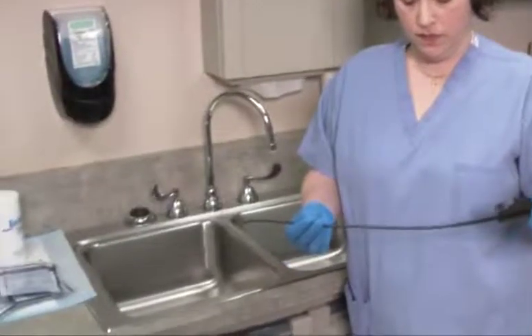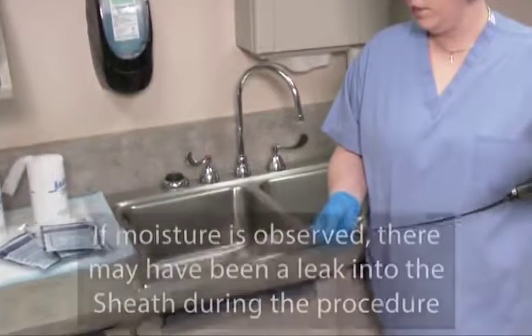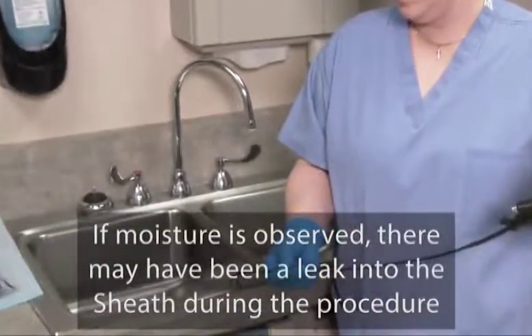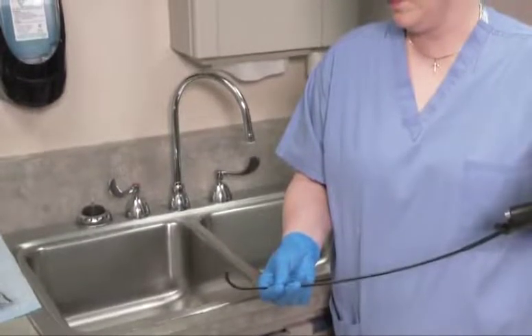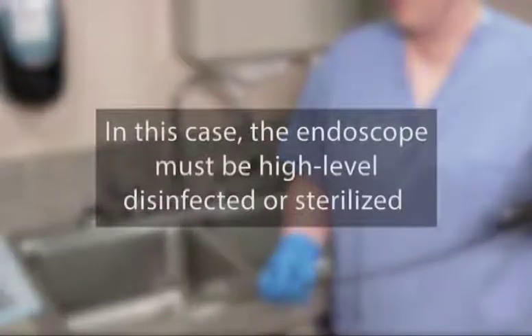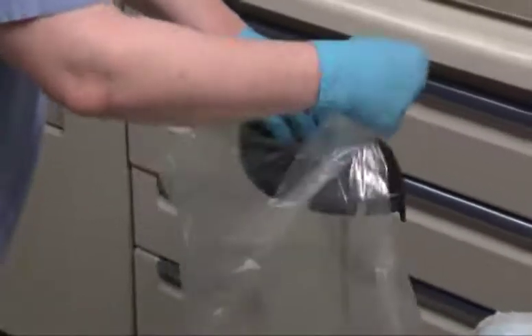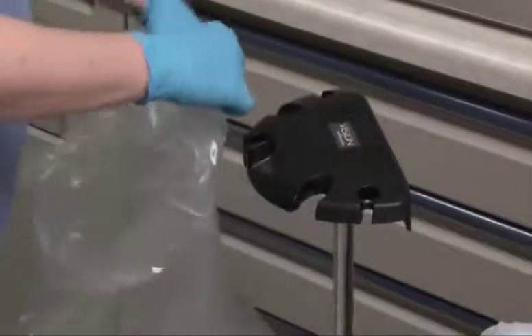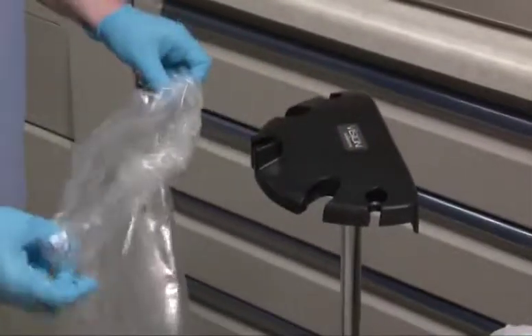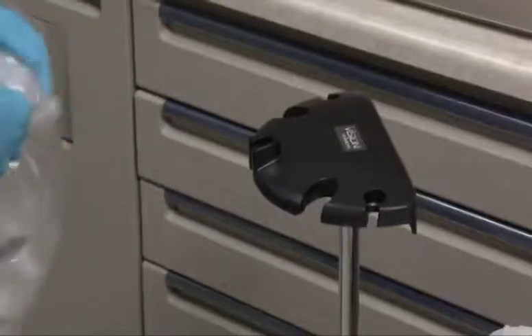Inspect the insertion tube and distal tip and confirm that these areas are dry. If moisture is observed, there may have been a leak into the sheath during the procedure, provided that the endoscope was dry when the sheath was attached. In this case, the endoscope must be high-level disinfected or sterilized. Fold the top end of the contaminated drape bag over the endosheath connector and remove it from the installation stand. Carefully discard the contaminated sheath per hospital or facility policy. The endoscope should then undergo the recommended cleaning and disinfecting procedure.